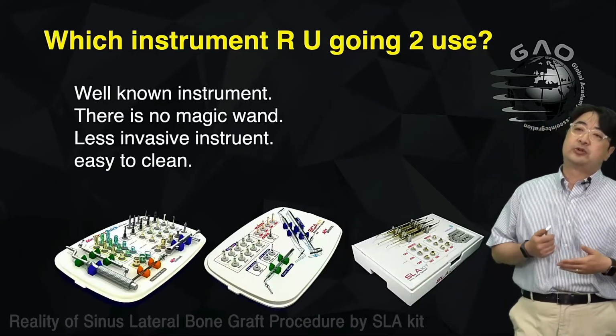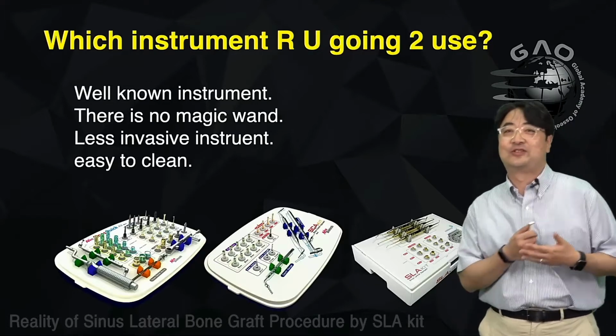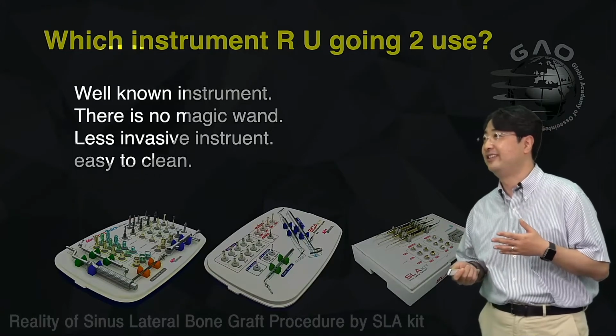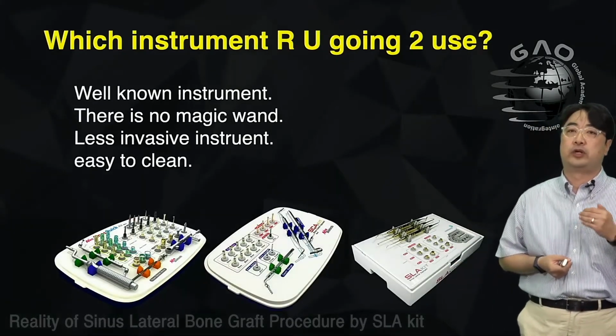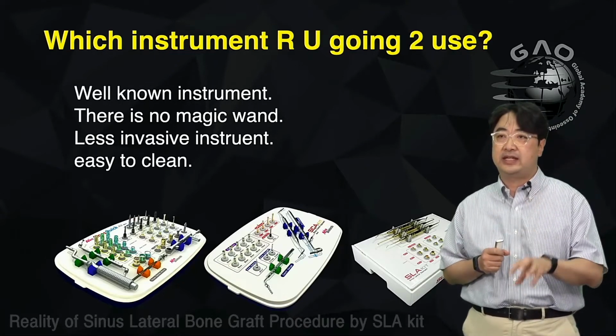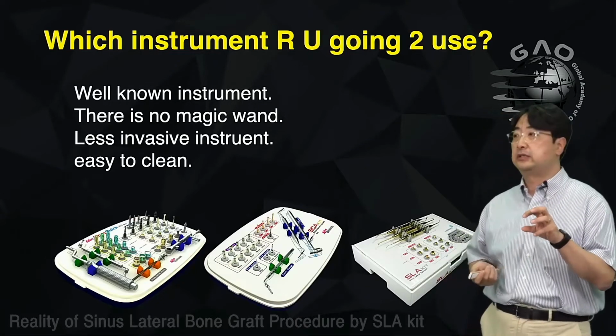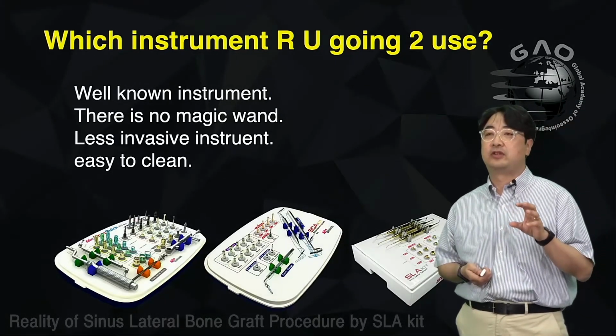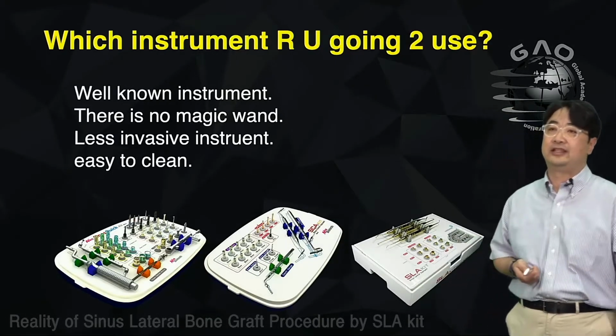Okay, so which instrument are you going to use for the sinus graft? Okay, it's better to use the famous one, right? But still, there is no magic wand, right? You have to get used to it, and you have to understand the mechanics of those instruments. It's better to have a less invasive instrument, and also you have to think about using something easy to clean, right?